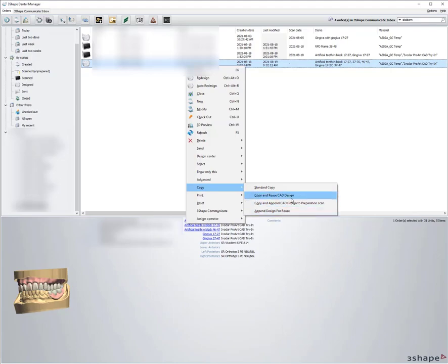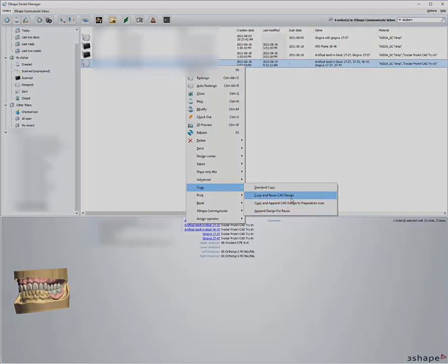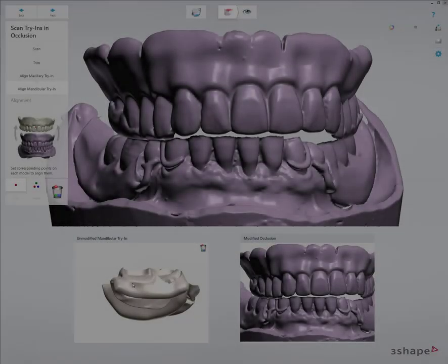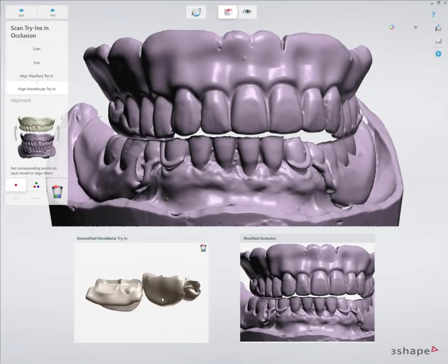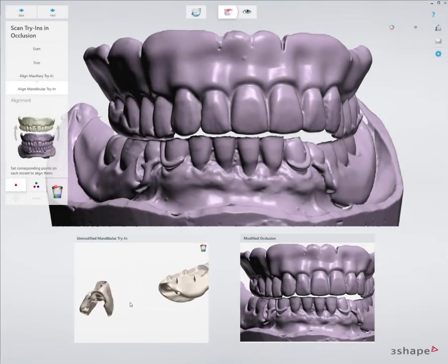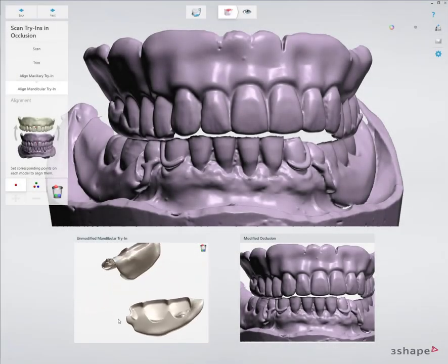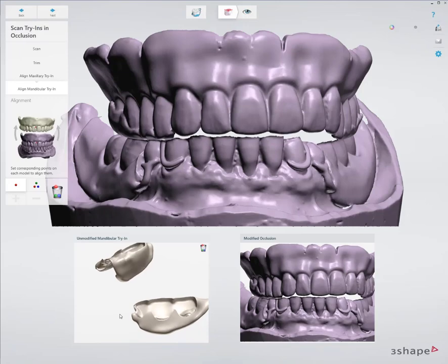And I scan everything in, when I go to align the lower, all I'm going to have to align it with is the tissue file.